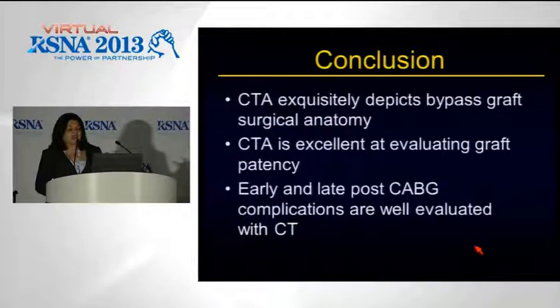But for the grafts themselves, if they've got multiple grafts, CT is excellent. I have also had patients who, as inpatients, had bypass grafts, say 2 days or 4 days ago, and the ejection fraction suddenly dropped. The patient is not a good candidate for cath.